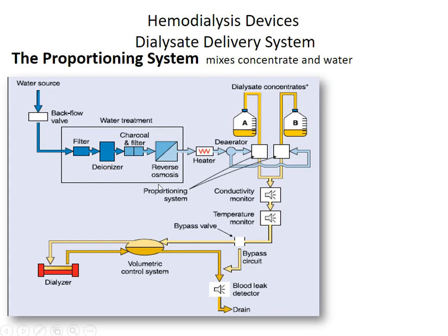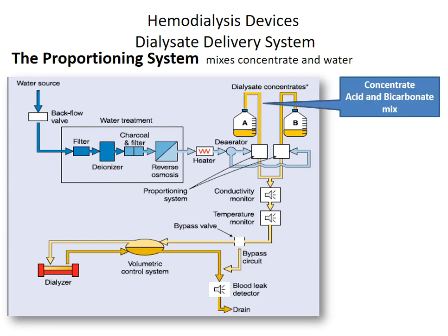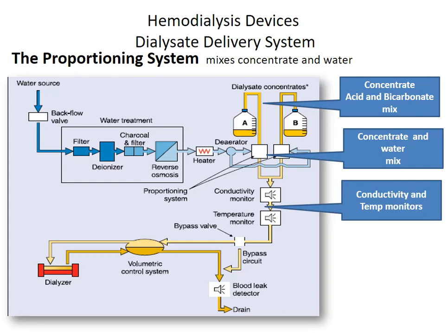Water inflow from the water treatment system passes through a heater, then mixes with a concentrate of an acid and a bicarbonate. Then we have a concentrate and water mix, which passes through the conductivity and temperature monitors.